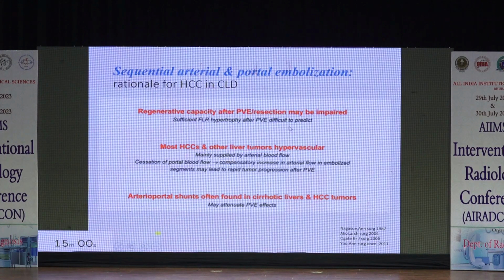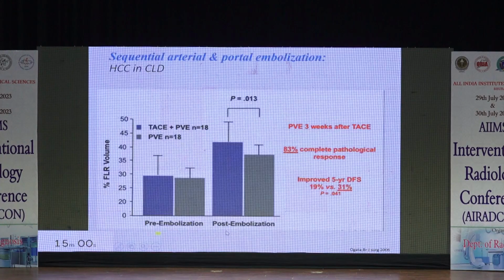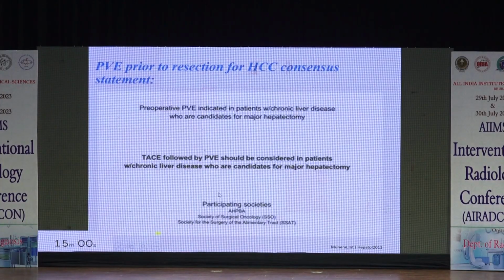HCC has to be controlled first using TACE, followed by portal vein embolization. These are the papers that have supported TACE plus PVE in HCC patients to have overall better disease-free survival rates. Another thing we can do is TARE. Yes, sir, definitely. Sir discussed it this morning. I have excluded a slide.